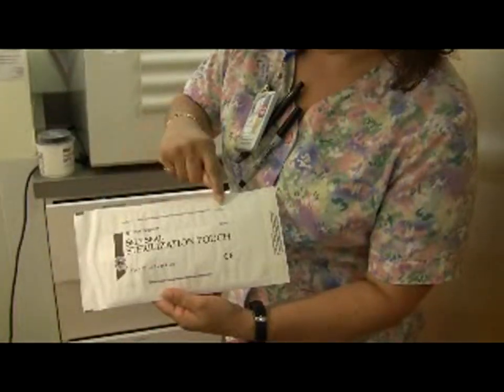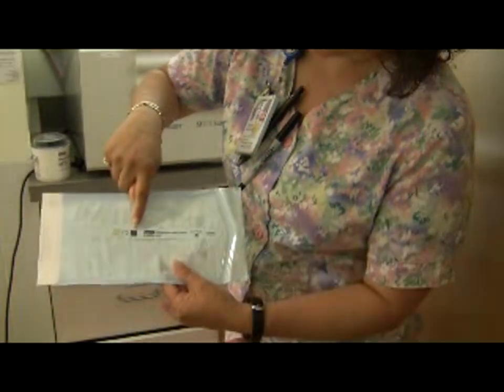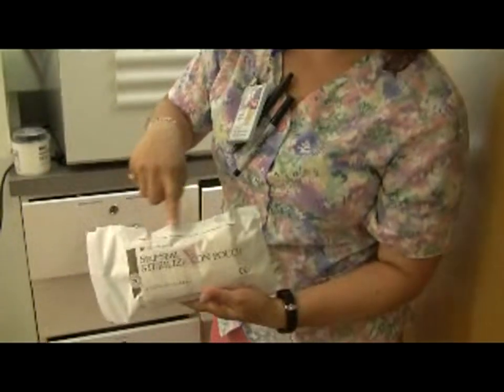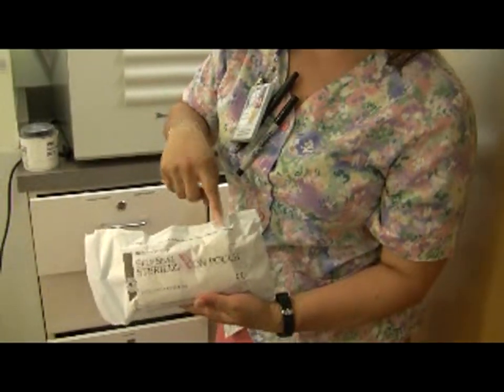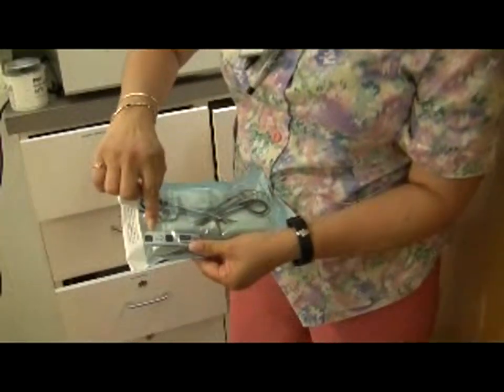Here it's blue to blue, and here it's yellow to black, and the other one is purple to purple, and this strip is black to black.